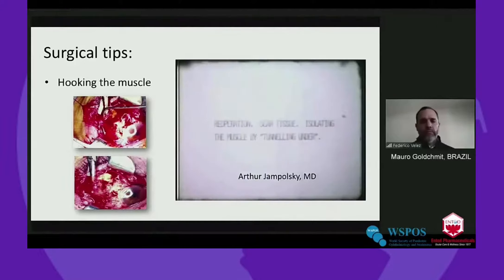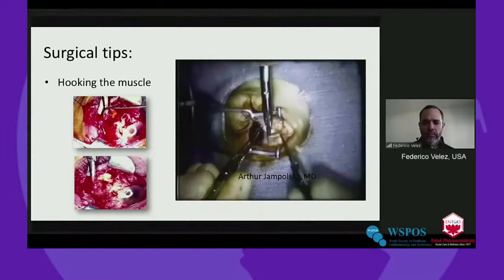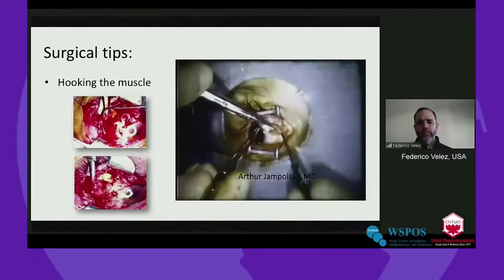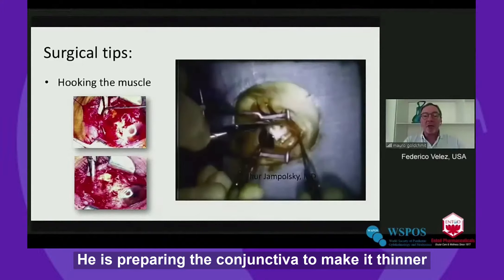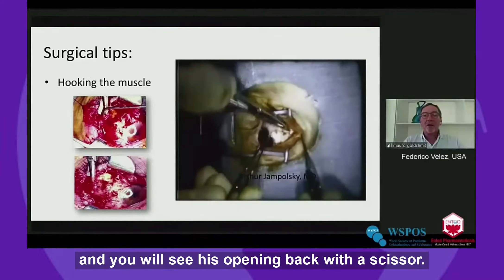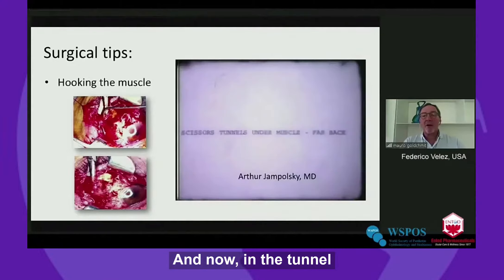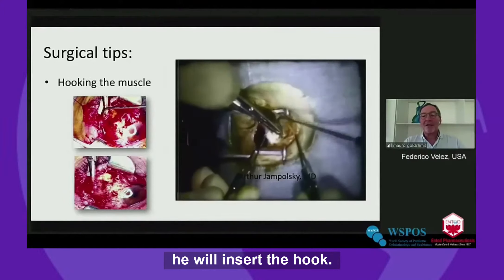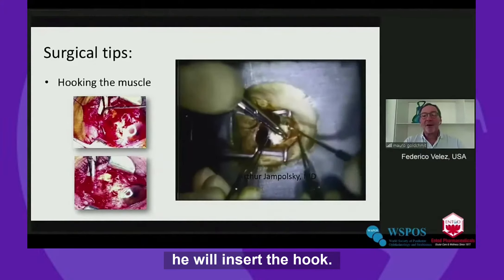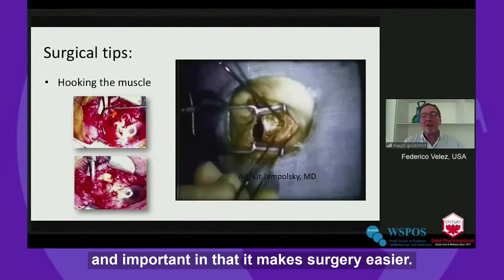In re-operation or in lost muscle, one wants to first prepare the conjunctiva for closing — undermine it well, thin it as far as possible while it's intact. It's a lot easier to do now than later. He is preparing the conjunctiva to make it thinner, and you will see him opening back with the scissor. Now, on the tunnel, he will insert the hook. This is a very nice tip and important that makes surgery easier.